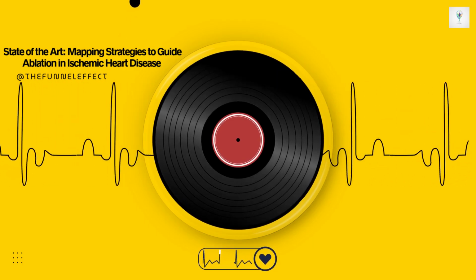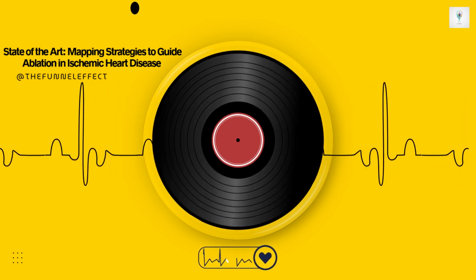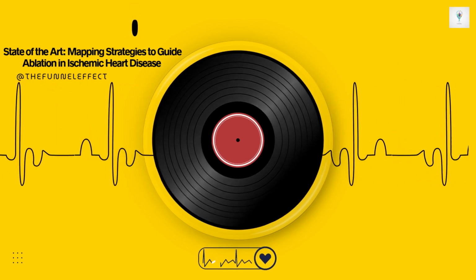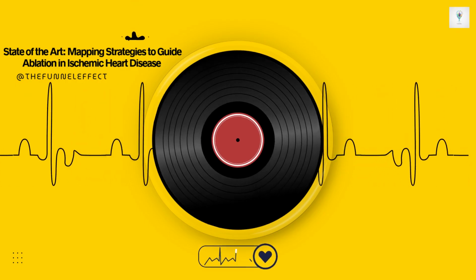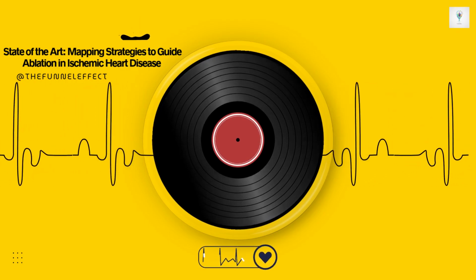Unipolar mapping uses one electrode on the catheter and a distant reference point, like a patch on the patient's back. This gives it a much broader perspective, a wider field of view. It samples electrical activity from a larger volume of tissue, including deeper layers. So it can detect scar even if the surface looks okay on bipolar.